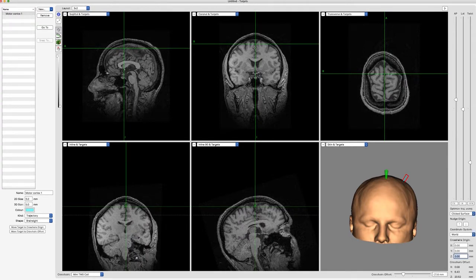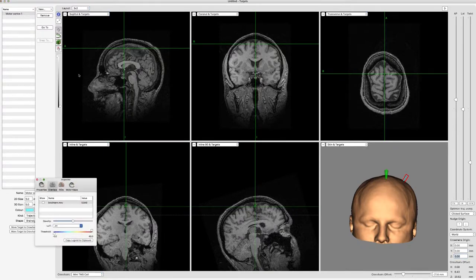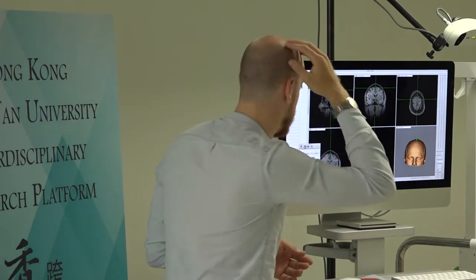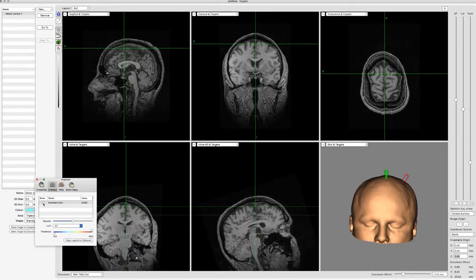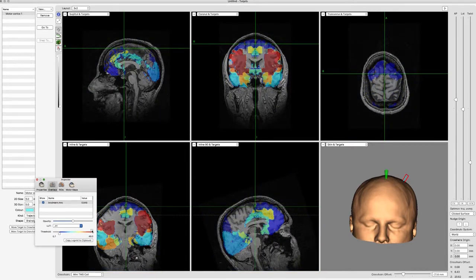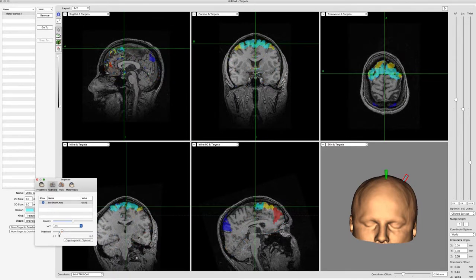Overlays. So the thing I took off just before, we can set markers using the overlays. So we've had someone earlier, they've come in, they've been in the MRI scanner, they've done a functional task within the MRI scanner to highlight a region of activity within the cortex. We bring that in there. We change the threshold to the area that we're after. So if, for example, it's the motor cortex, let's say we want number 4, which is that nice light blue one. So bring that down.